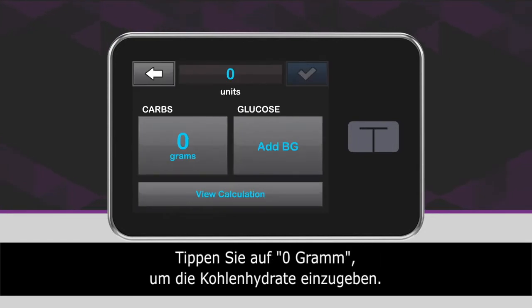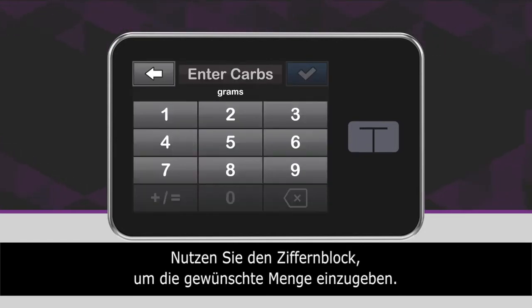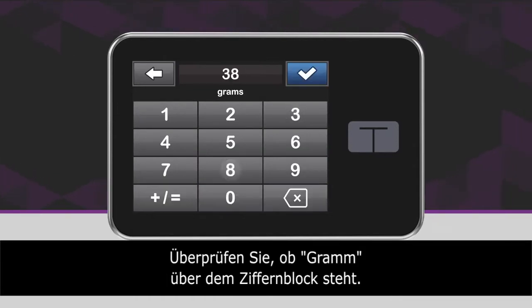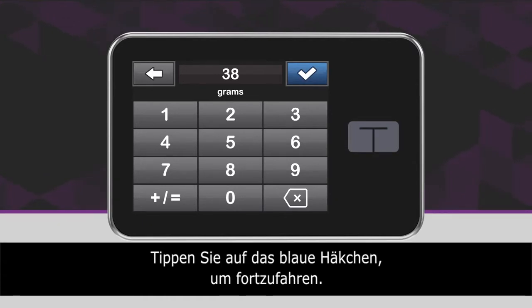Tap zero grams to enter the carbs for your bolus. Using the keypad, enter the desired carb value. Be sure grams is displayed above the keypad for food boluses. Tap the blue checkmark icon to continue.